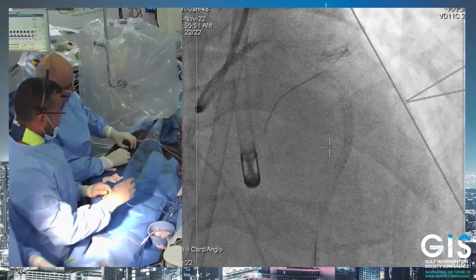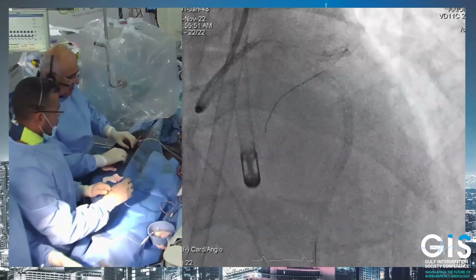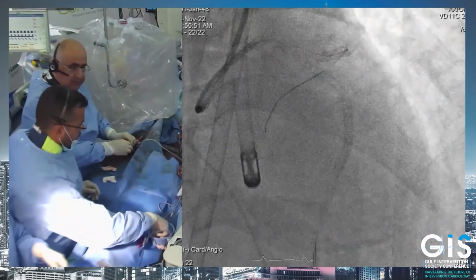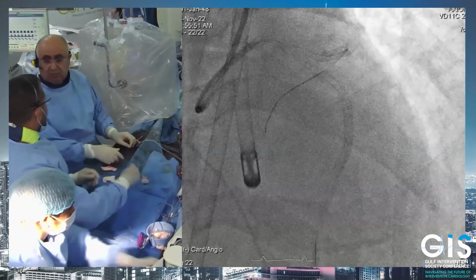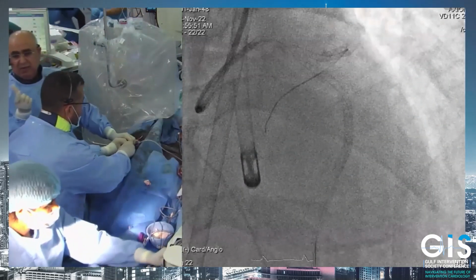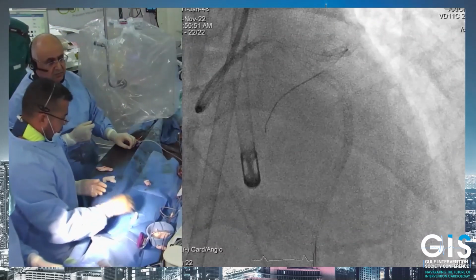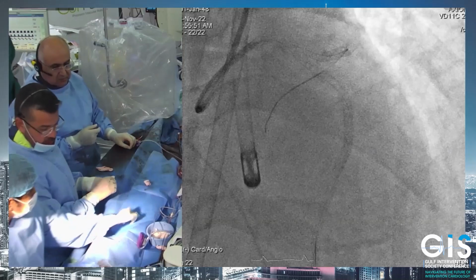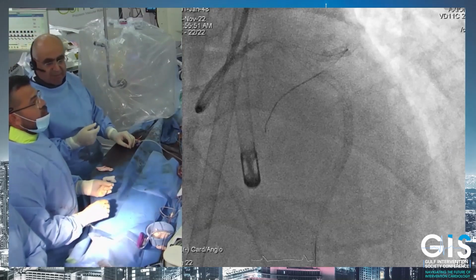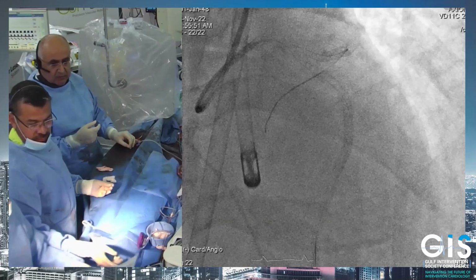A few tips would be: can I have an angled microcatheter or balloon, please, using wires that have less tendency to prolapse? Give me imaging, give me an OCT. And then the question is whether I can cross. The stenting strategy of the LAD to left main: one scenario is to try to nail the ostium, but this strategy has some known limitations which were discussed in the previous session. Another is extending all the way to the left main, or sometimes I've seen people do a floating stent. And again, there are some pros and cons of this technique.